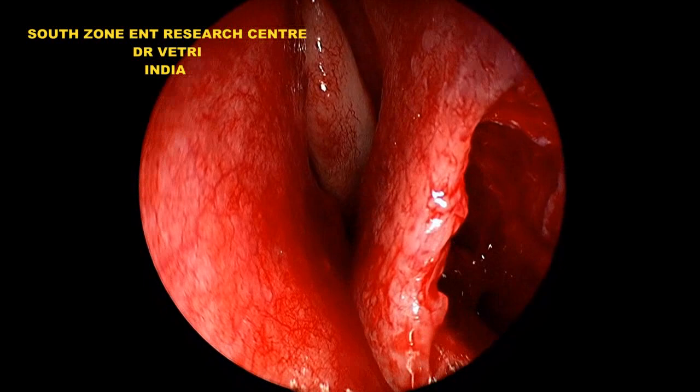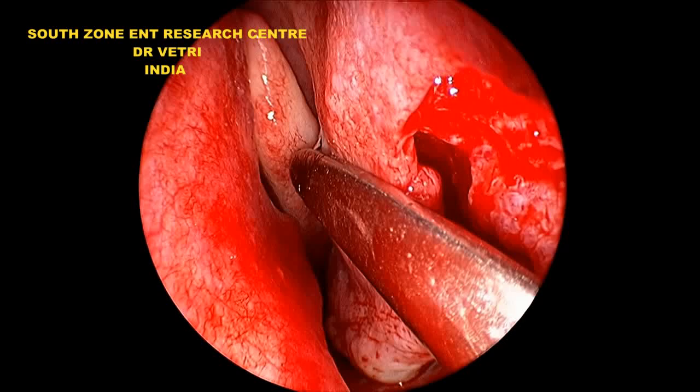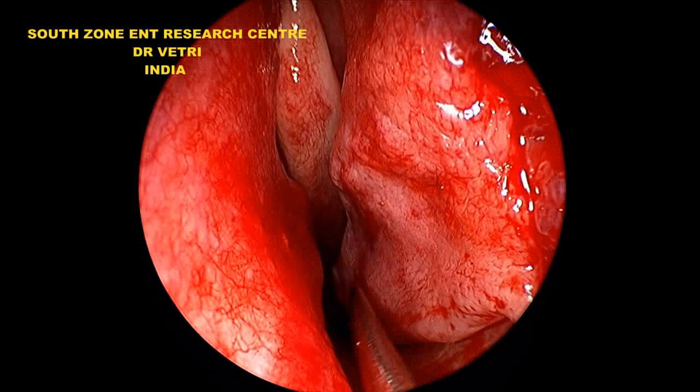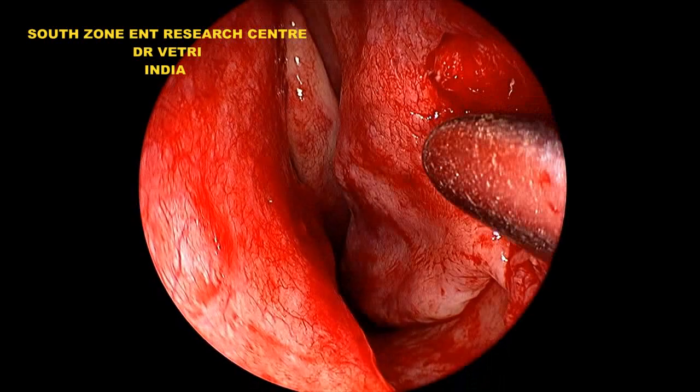Now a bit of soft tissue in the posterior-middle part is divided. We can now see the result on the table and the patency of the airway in the anterior part. The patient is comfortable throughout the procedure with no signs of pain.